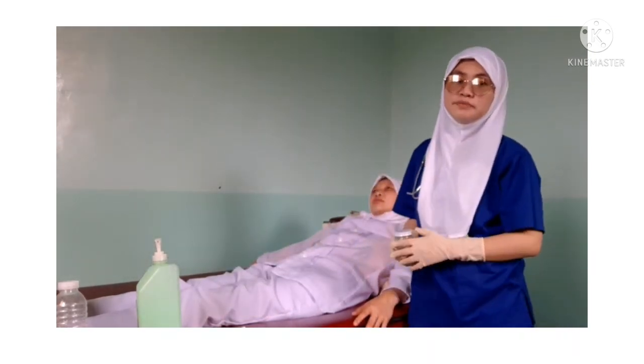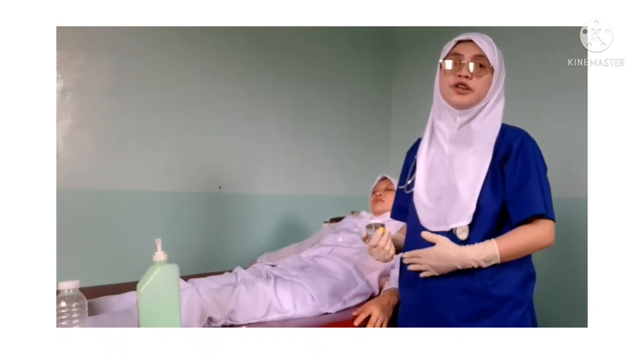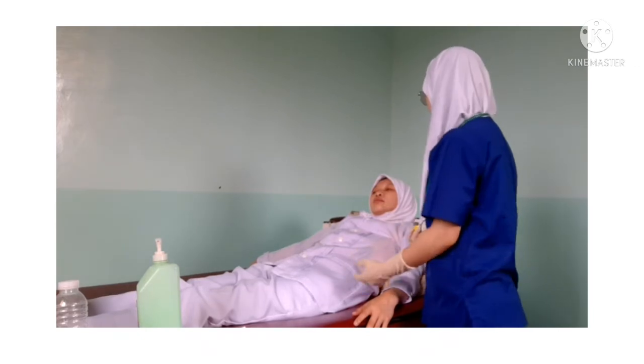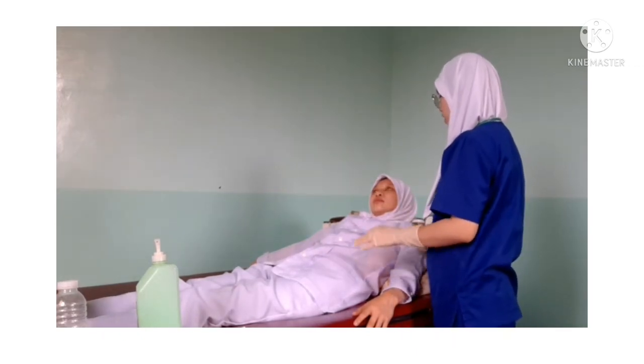Let's instruct the patient to breathe using her abdomen 3 times. So, ma'am, breathe in using your abdomen 3 times. And direct cough.